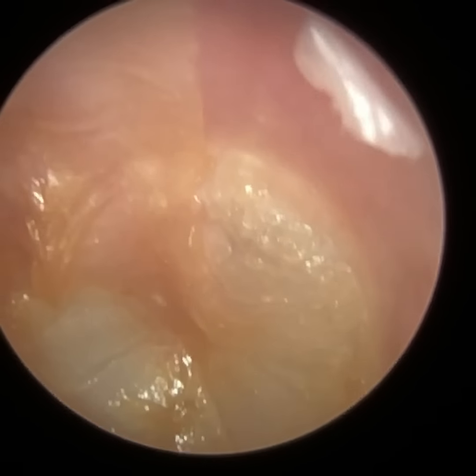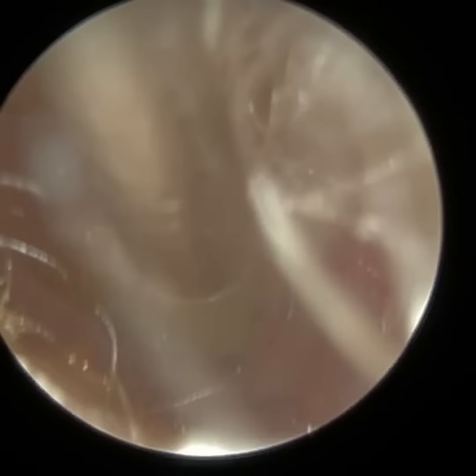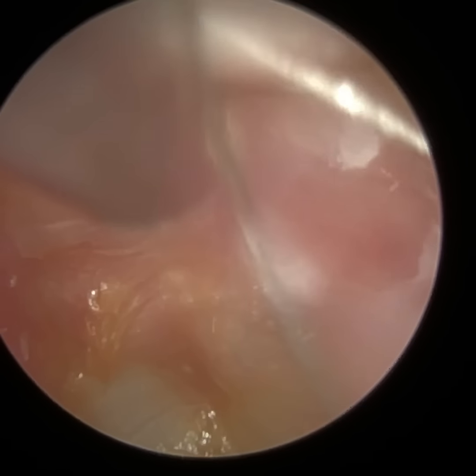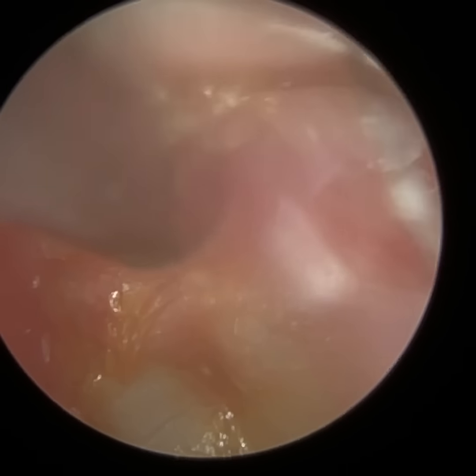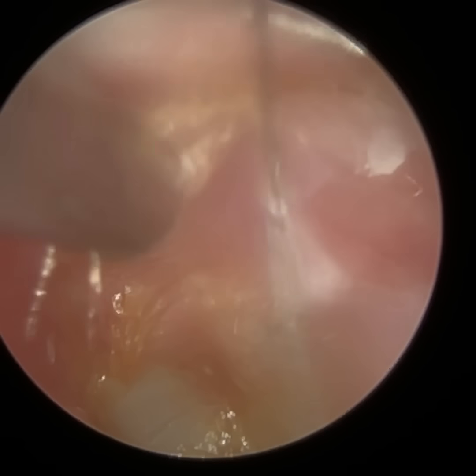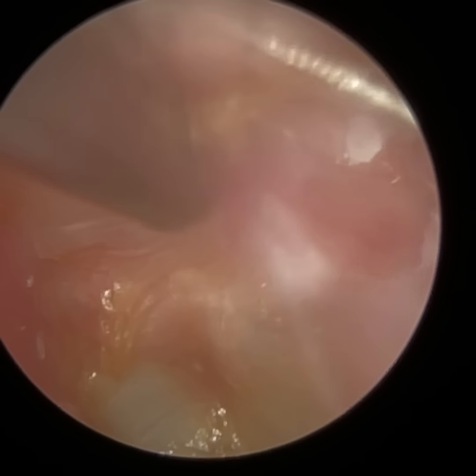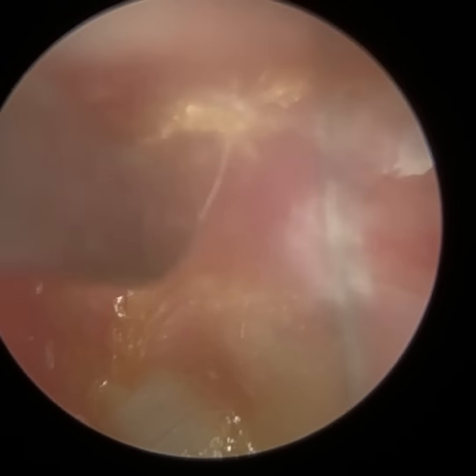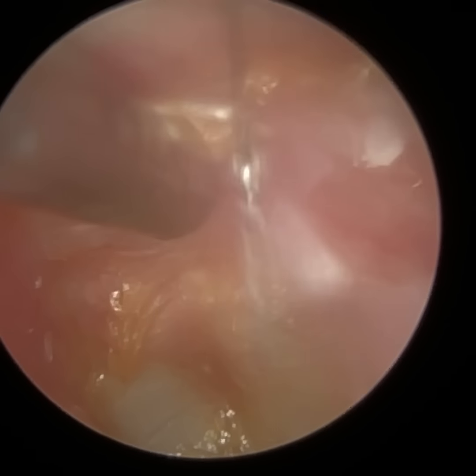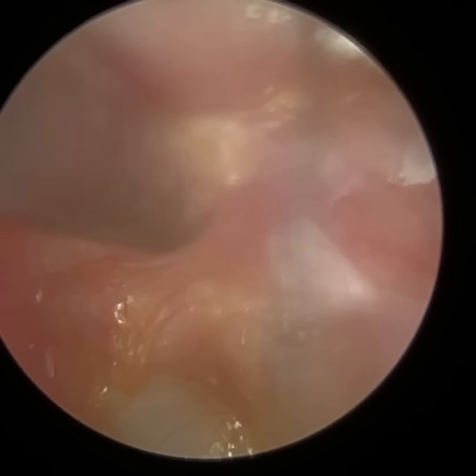So some patients can literally faint and pass out on you. It's short lasting, just for a few minutes, and they should recover. Similarly with the caloric effect, you come out of the ear and you're just waiting for the ear temperature to resolve itself and your eyes to correct your brain, and the caloric effect can be soon resolved. But they did get a bit dizzy, so we just left that thinnest layer on the eardrum. It wasn't going to affect them massively.